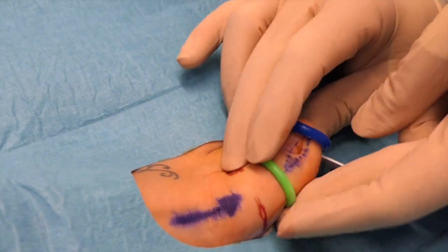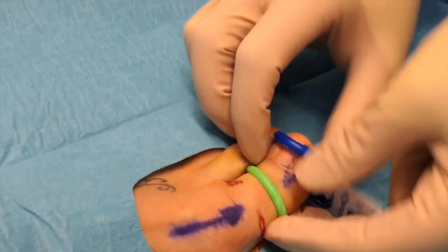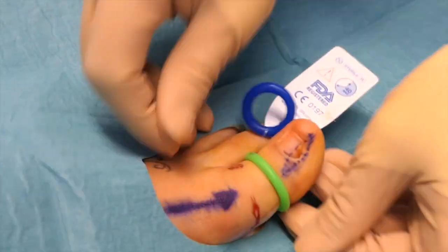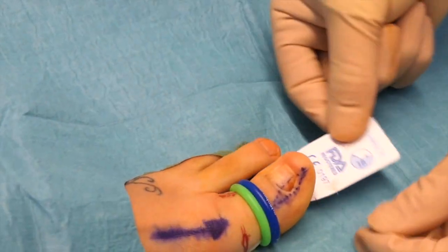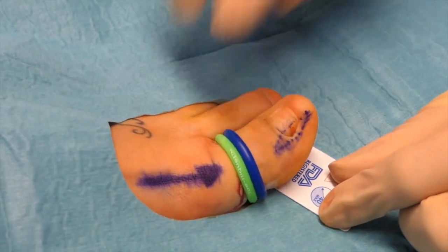So these particular tourniquets come as a pair, so I generally stick them both on. As you can see, it's the most difficult part of the procedure. I shall edit that bit out. They come in two sizes, too big and too small. So I generally use the pair. And we've got the little tag, the tag needs to stay on. That needs to be pushed back to give us room.